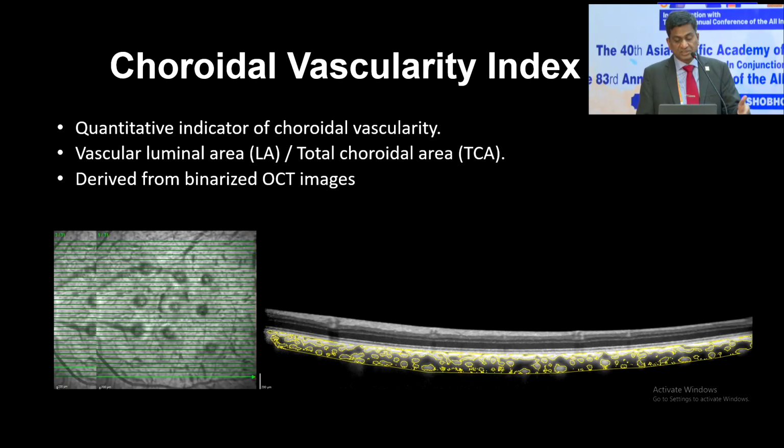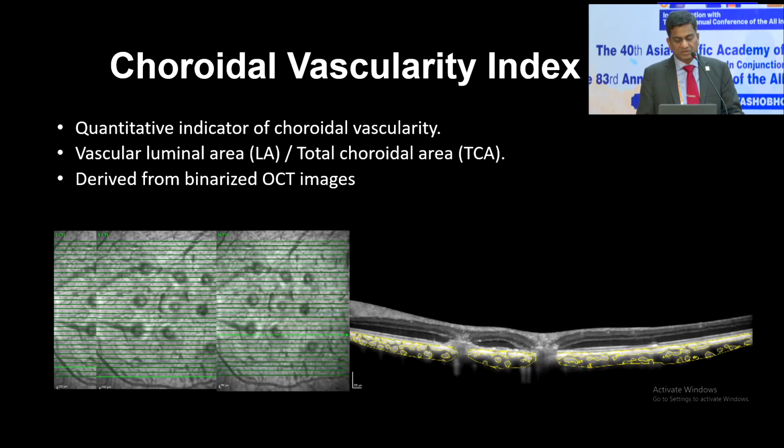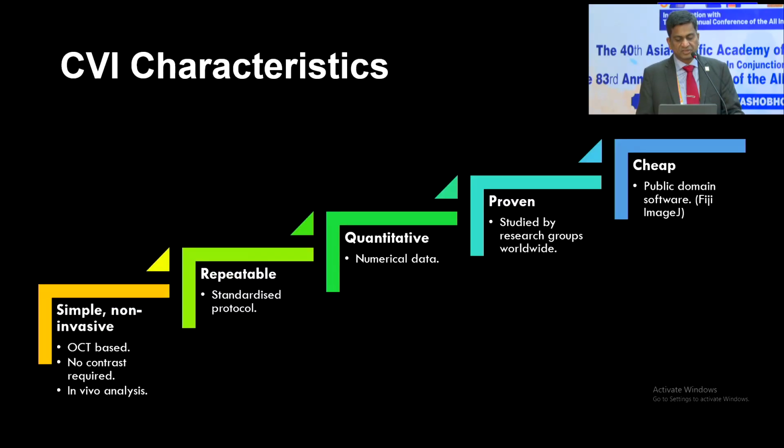And these are some images from animal eyes which underwent laser, and we thought we'd segment them and try to understand what's happening here. So these were the segmented images of the choroid, and we were trying to see whether it was getting segmented nicely. I will say maybe 60% of the images were able to segment, but not all 100%.